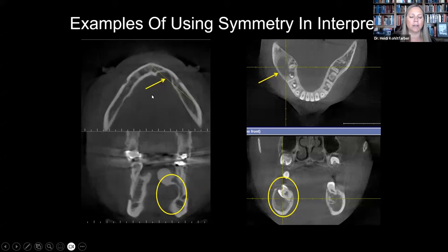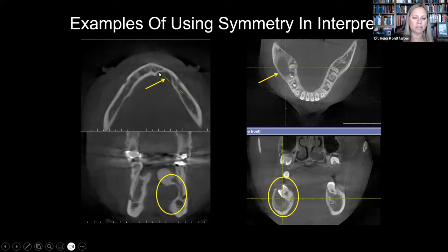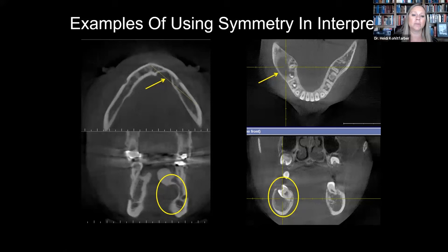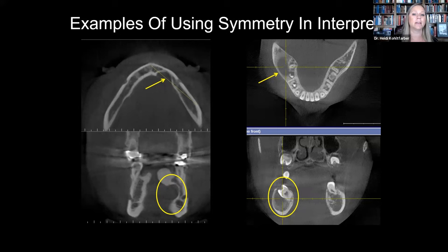Here's an example of using symmetry. In this particular software, the patient's nose is up. Here's our anterior mandible. You can see when looking at those cortical borders, it looks a little different on one side. In the coronal sections, it also looks a little different — we do have some large lingual tori, but it almost looks like something is pushing in on that bone, while the cortical borders are still intact. This is actually an anterior Stafne bone defect. But even if we didn't remember that, we would notice something looks different and easily refer that out to oral maxillofacial radiology.